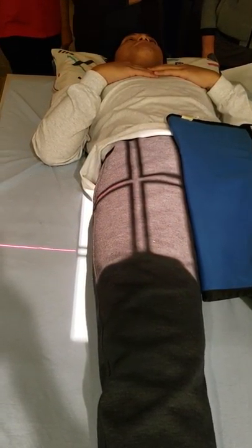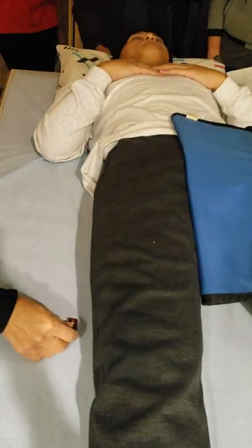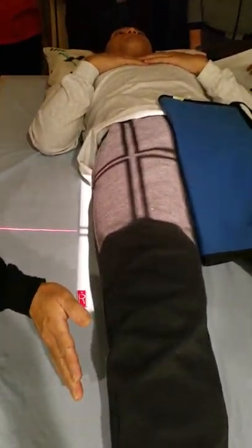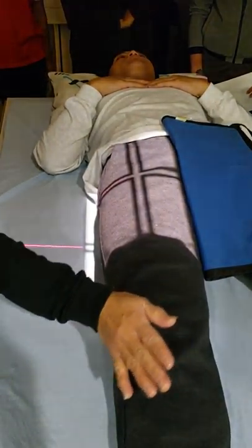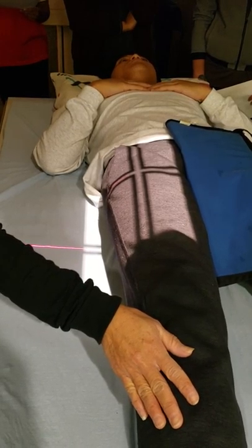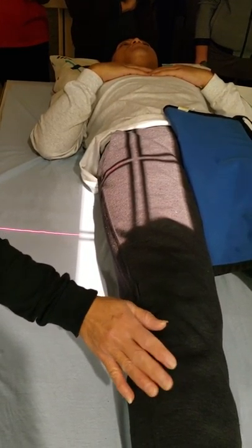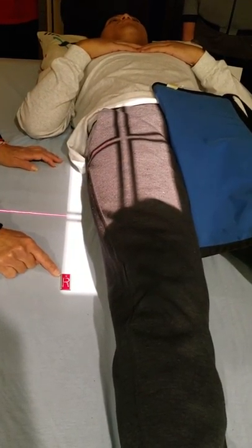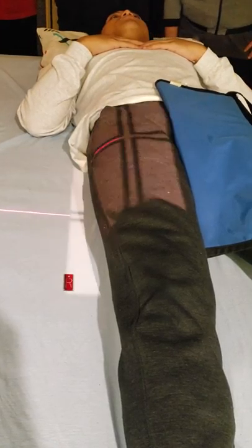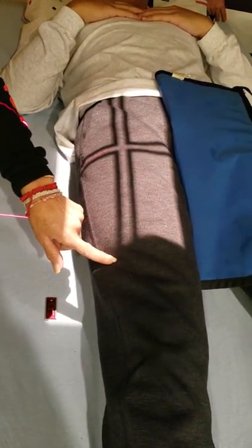I'm using the left side marker. My marker is placed right in there. If you know for sure the patient has no injury or is able to move the leg, you might ask them to rotate the leg inward just a little bit. But if you suspect a fracture, do not do that — most likely the patient will let you know they can't move it. So the patient is shielded, I should be getting the joint included here at the ASIS, down the full length. Put the marker as a signal — that's field number one.